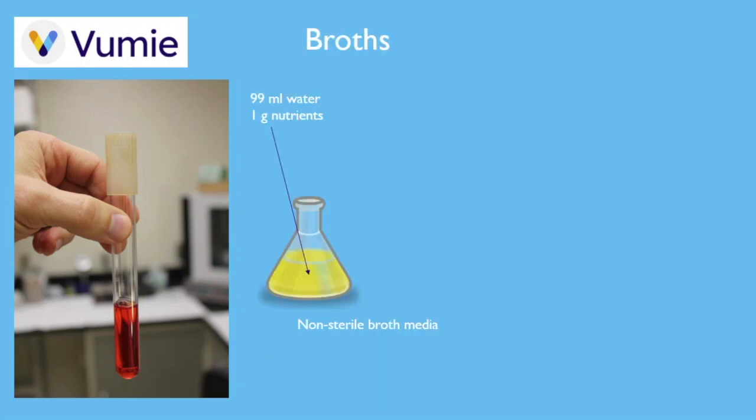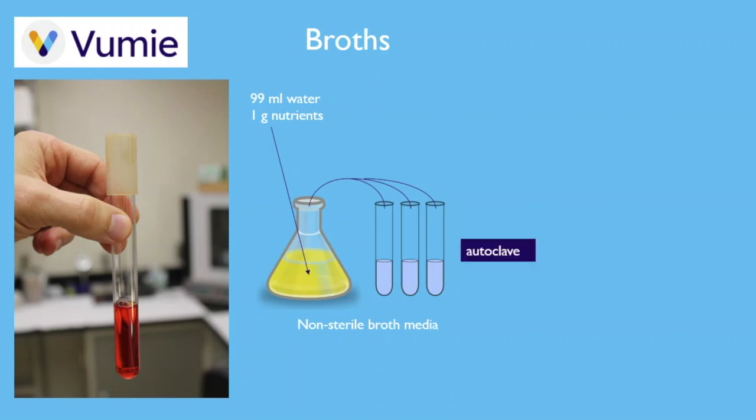Liquid media are called broths. If you dissolve nutrients into water, you have created a broth. They are mostly water, and many broths are over 99% water. Broths normally are dispensed into culture tubes and then autoclaved to sterilize the contents prior to use.